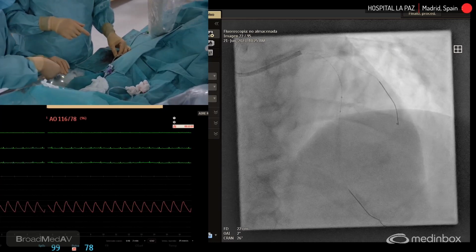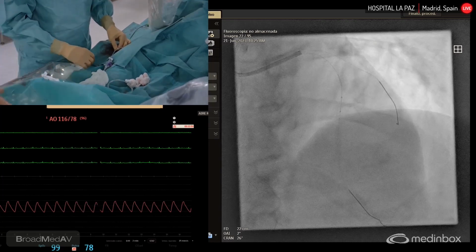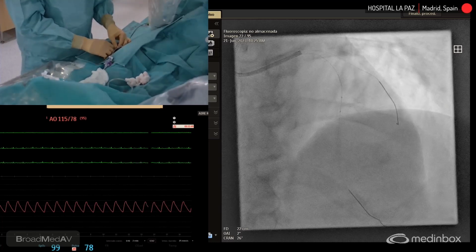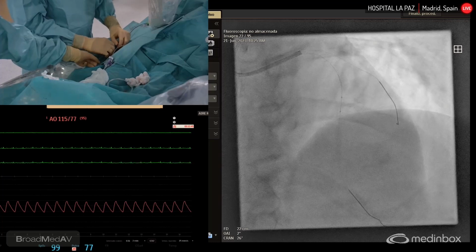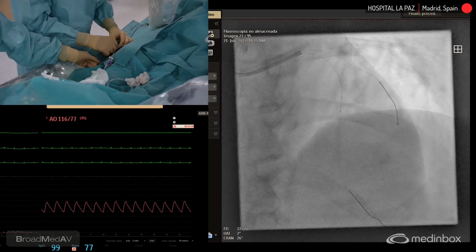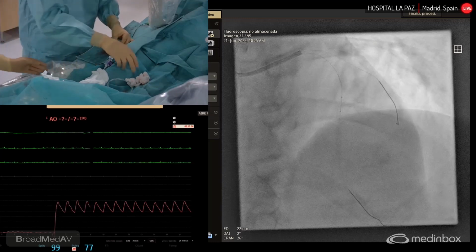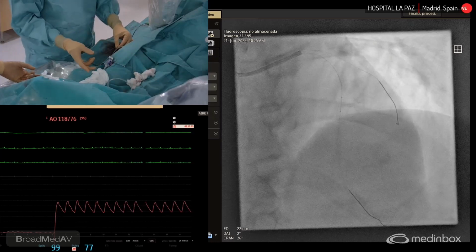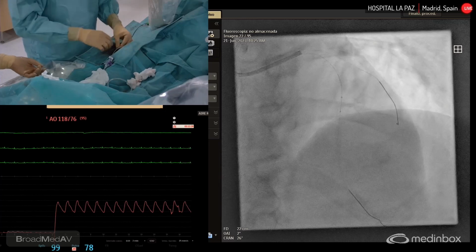Okay, so this is a very interesting trial we are very involved in, because we are always thinking which is the best stent. All of them are quite good. All the platforms we use now are quite good. And some colleagues think that probably the ultra-thin platforms are the best one in every case.